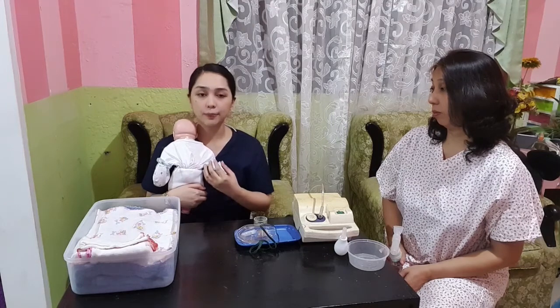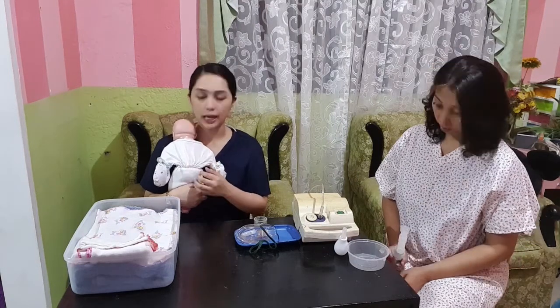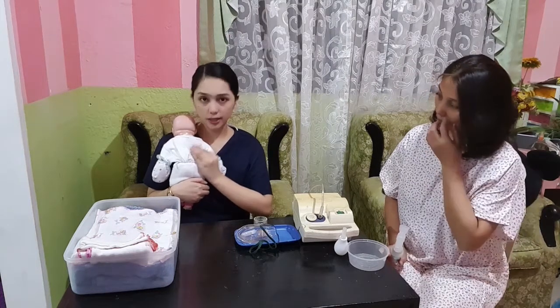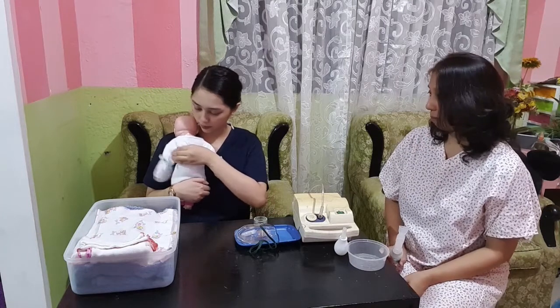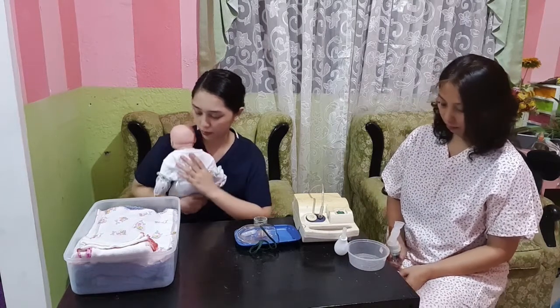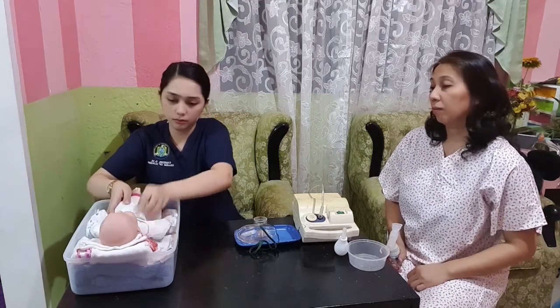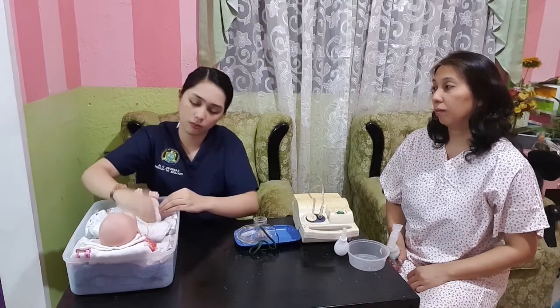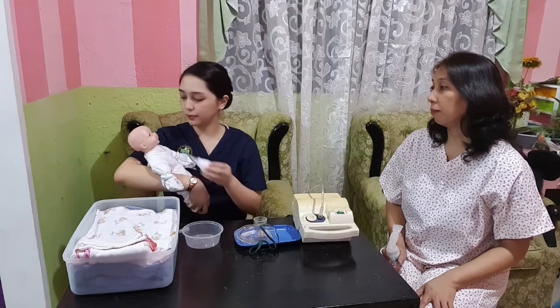So for the infant, when we do chest and back clapping, make sure not to hit the spinal cord of the baby. And then lightly tap the chest or back using my cupped hand. And then suction.